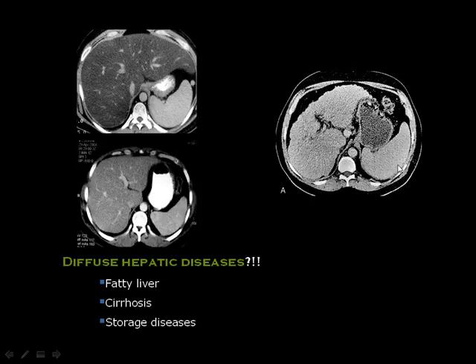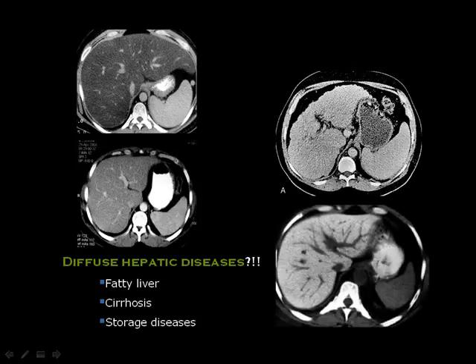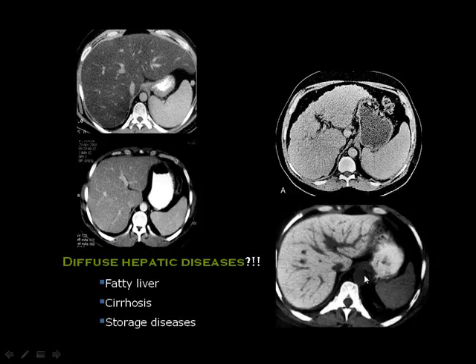In a cirrhotic liver, you see the liver is shrunken with irregular outline and the spleen is enlarged. If the non-contrast study shows the liver is denser — brighter — than the spleen, this suggests diseases such as glycogen storage disease, hemochromatosis, or hemosiderosis, where material deposited in the liver parenchyma elevates its density compared to the spleen.